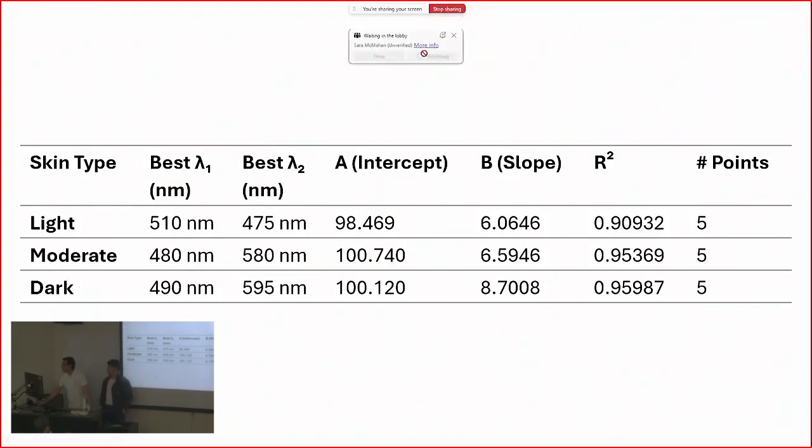So we have run a few tests using MCX software. Since we had a few issues calculating SpO2 using Beer-Lambert's law, because it's a very complicated formula and we need to account for so many things, and also we might need to calibrate it. I don't know yet, we're not there yet. So we've used the traditional way to calculate SpO2 using reflectance mode.